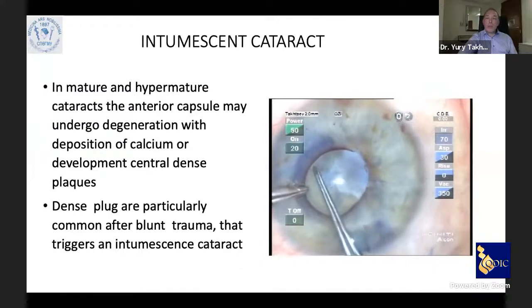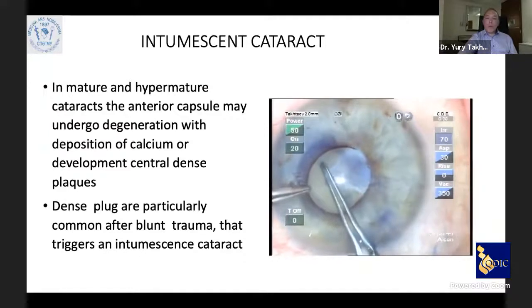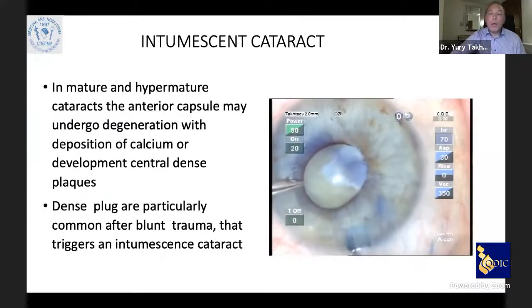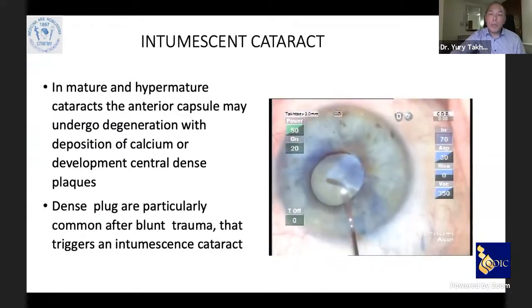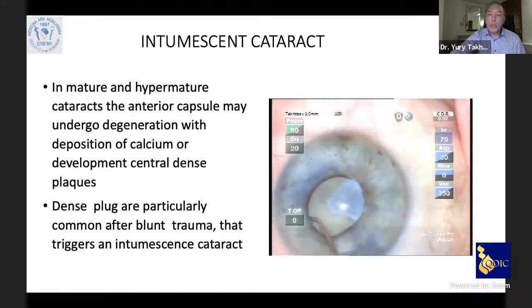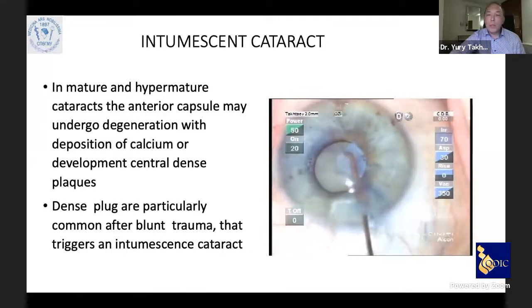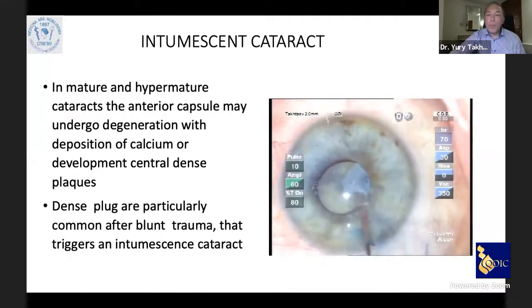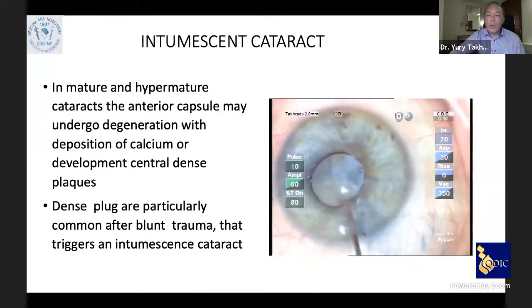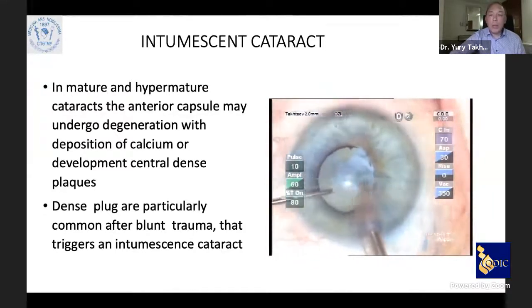but the plaque is still present. We reduce the capsule. And this is just the superficial part of the capsule, because the plaque and the other capsule are still present. I try to rotate the nucleus, and you can see at 6 o'clock the capsule is still present, and we have a tear in this area, and the rhexis is not completed. So we just remove the superficial part of the capsule, and this is the problem.